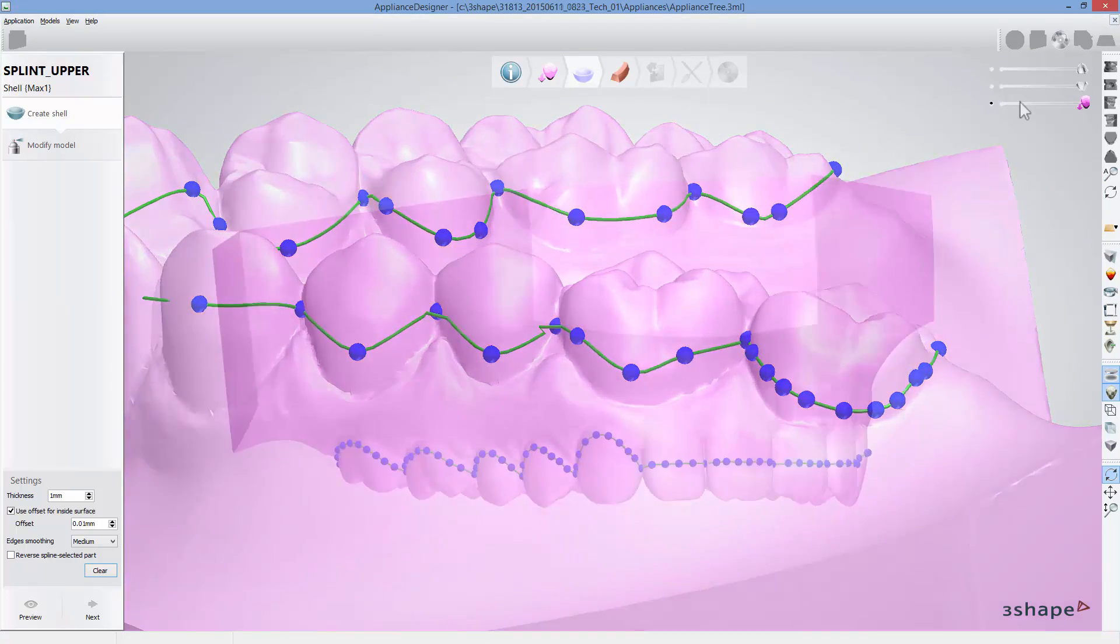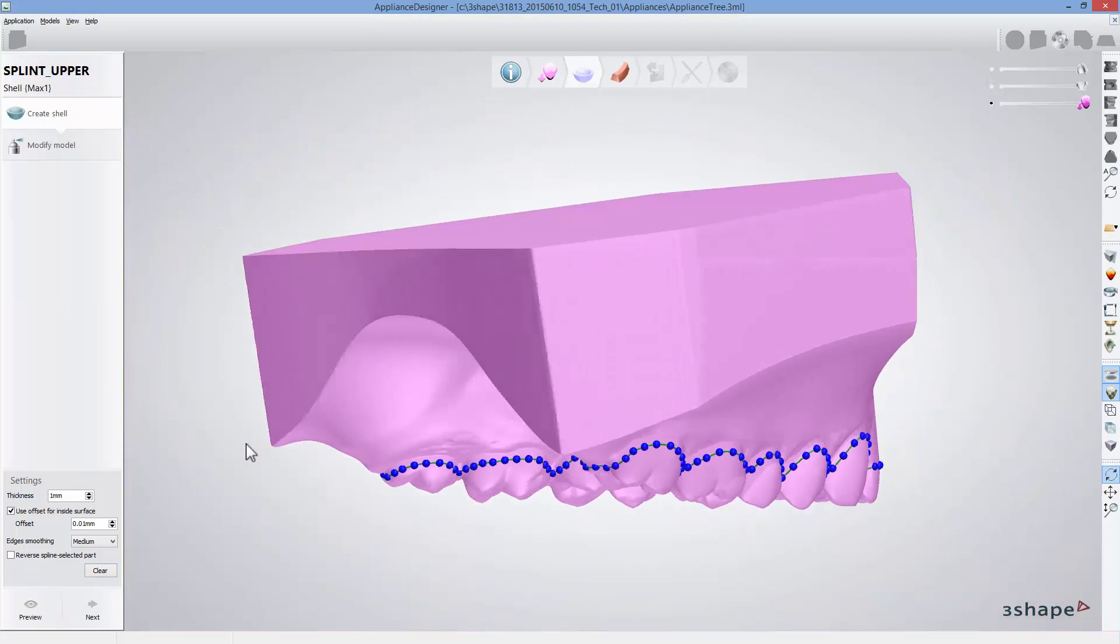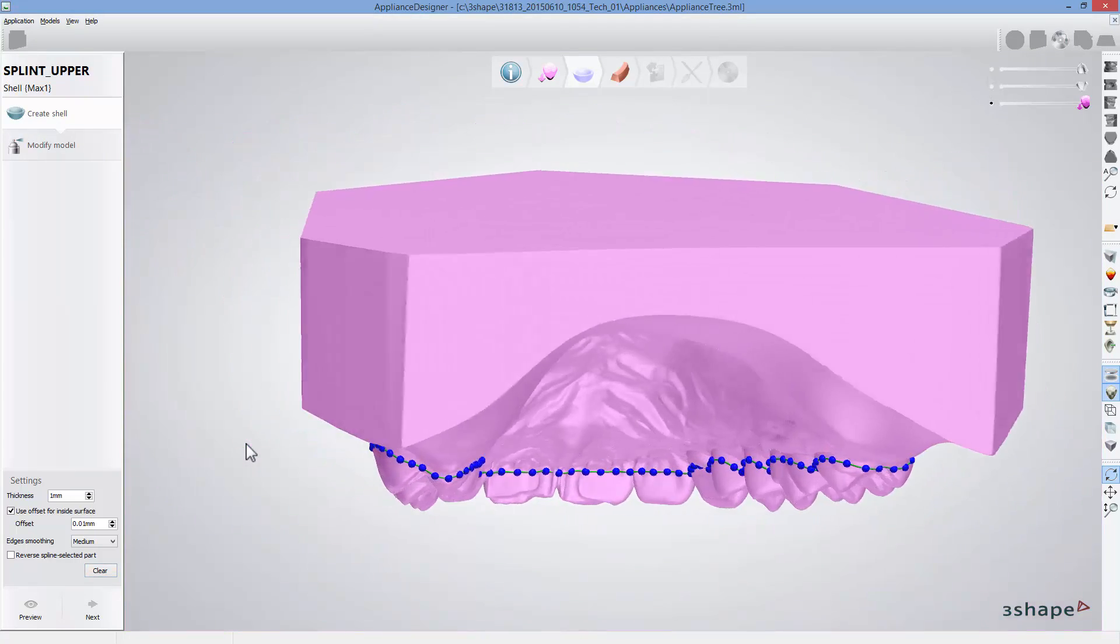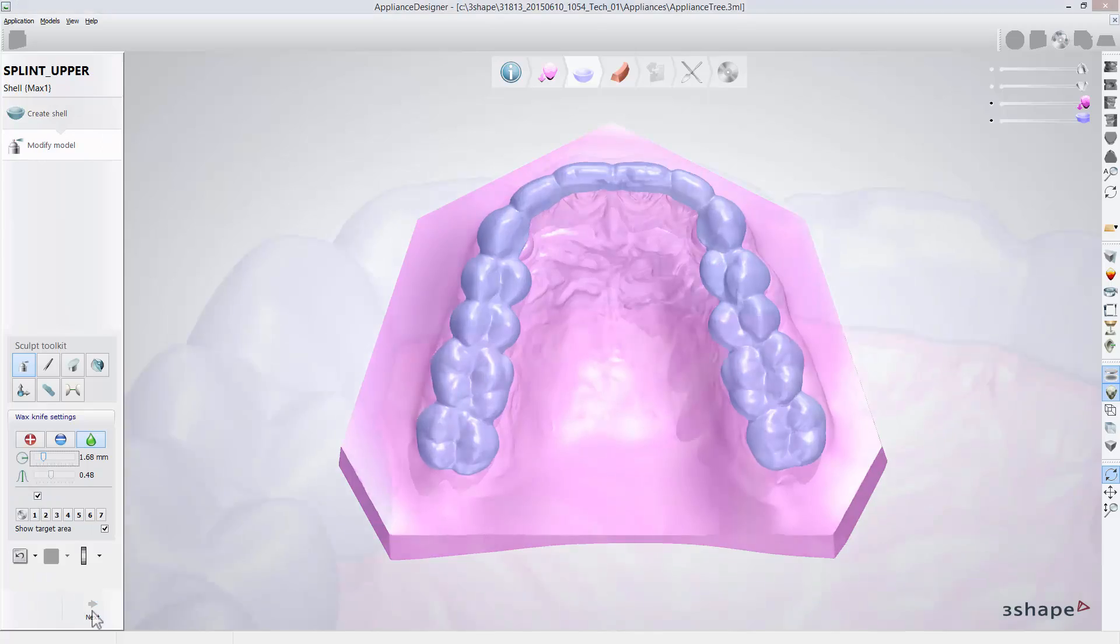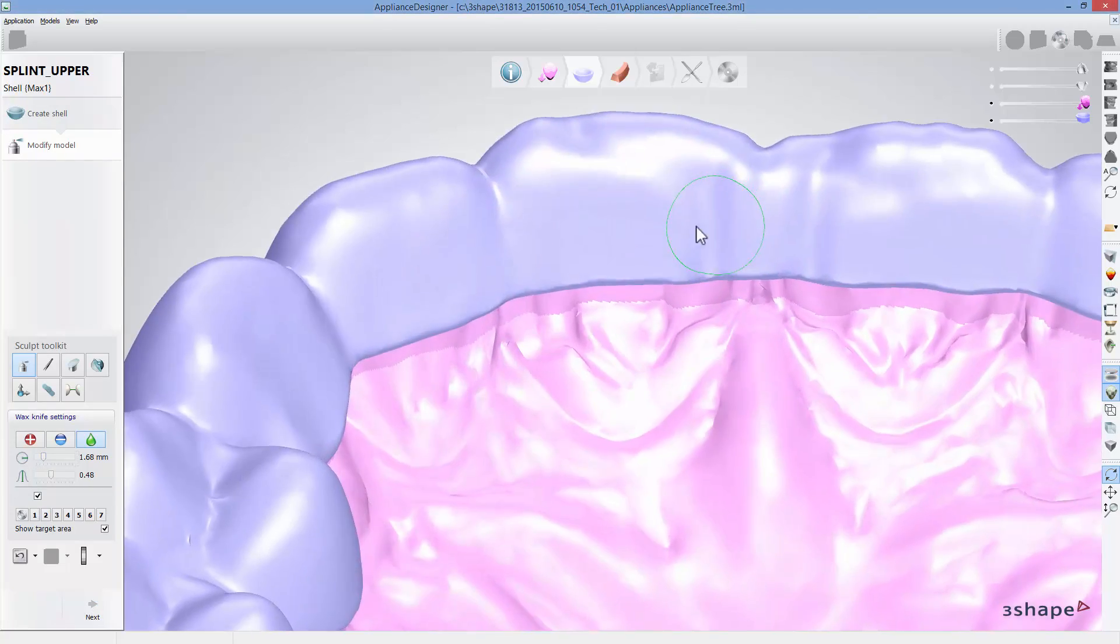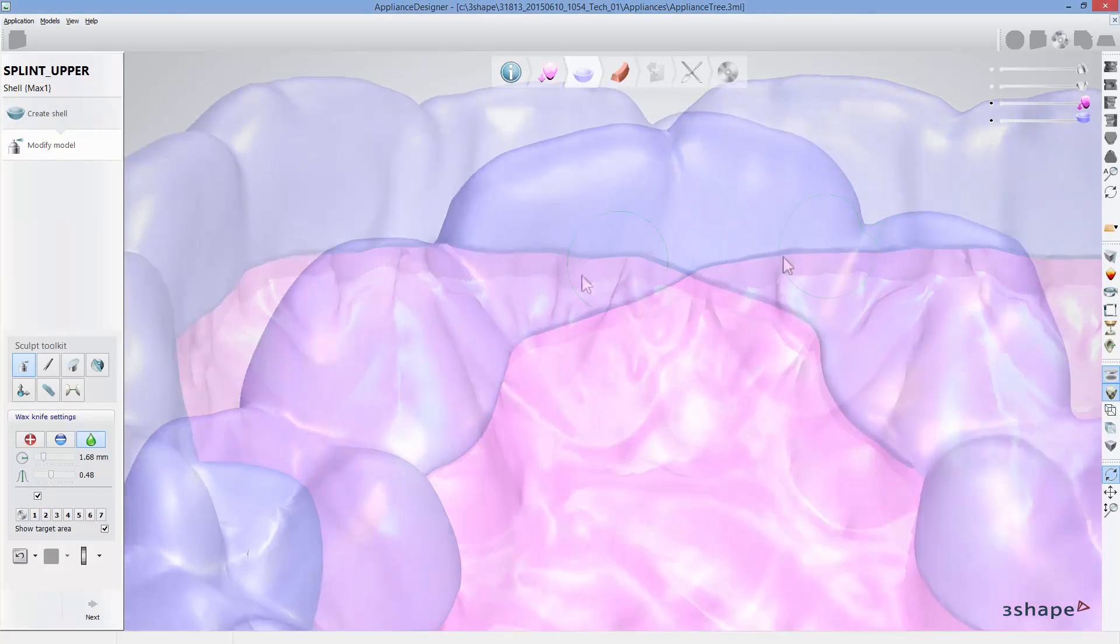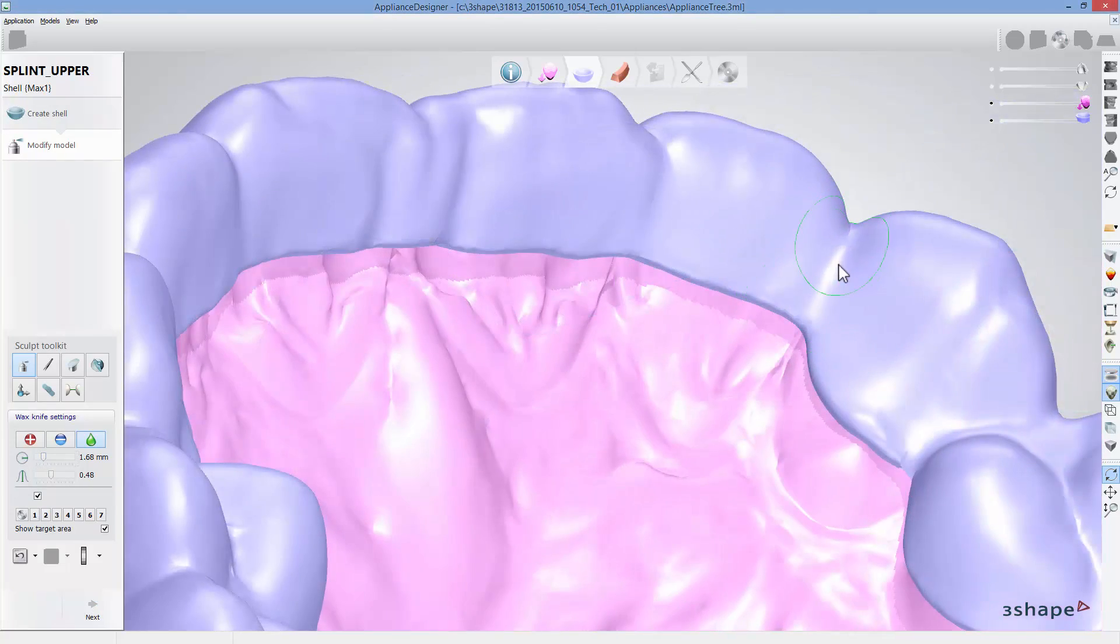When the margins are set, click preview to see how your splint will look. If you are happy with the design, click next. Now you can adjust the design using standard sculpt toolkit.